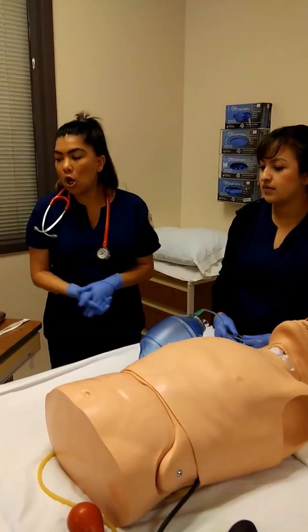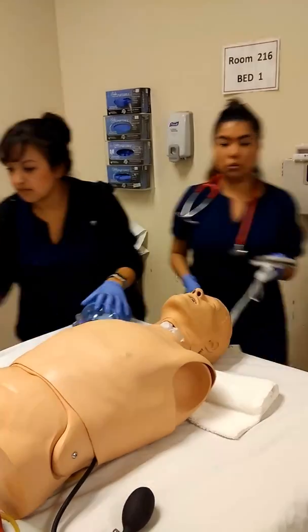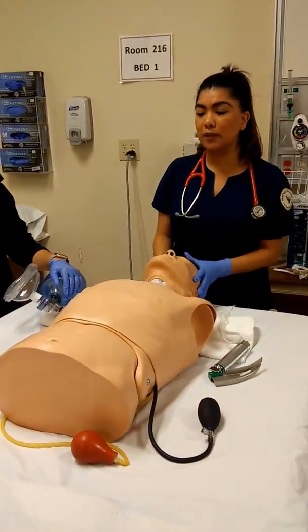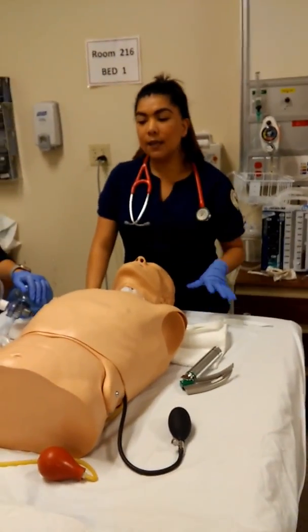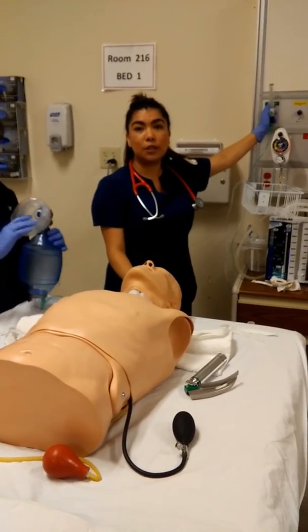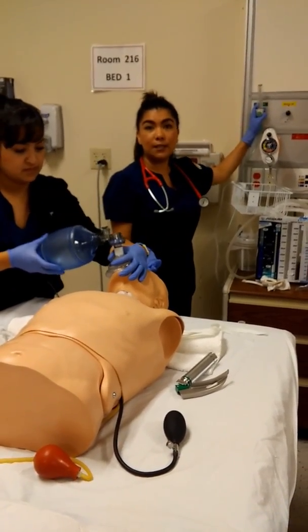No? Okay, thank you. What I'm going to also do is go ahead and obtain the patient's vitals. So I want to listen to their breath sounds, check their heart rate, their O2 saturations, and I want to make sure that I have a towel as well, for the patient's comfort. And I want to make sure that our oxygen is properly working, because when you're going to intubate a patient, we want to make sure that we fully oxygenate the patient prior to intubating.